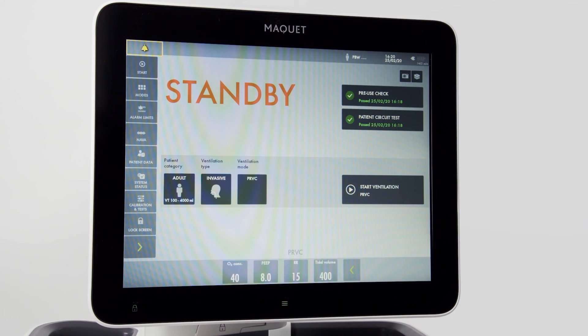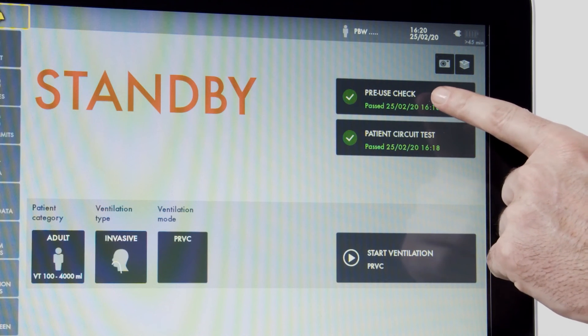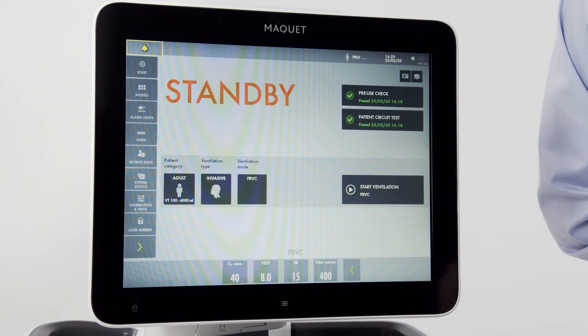Once the pre-use check is completed, we are taken to the standby screen. Note that no ventilation is occurring while we are on standby. In the upper corner, I can see the results of my pre-use check and my patient circuit test. I can also run the circuit test separately.